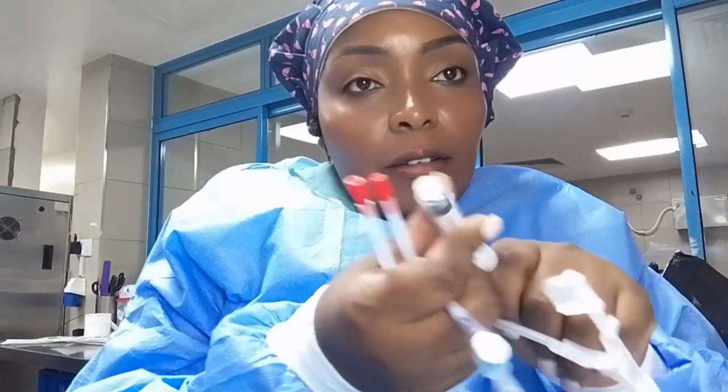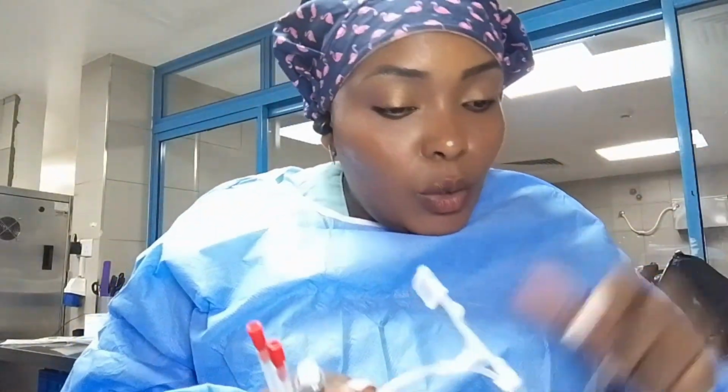This is a flush. Then sutures. I showed you sutures. Then you have this one, a blade, and it is number 11. You will also require a blade. Then a transducer. You have a transducer. You will need it in this procedure.